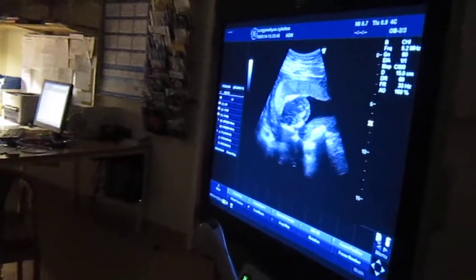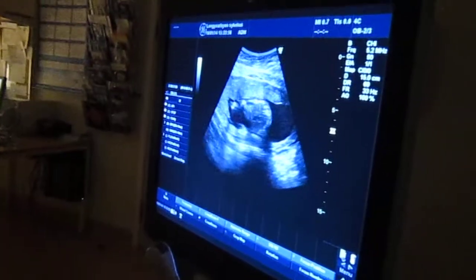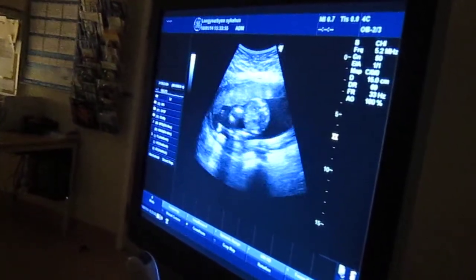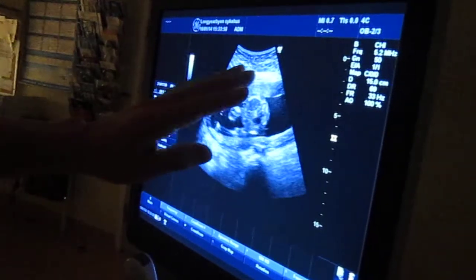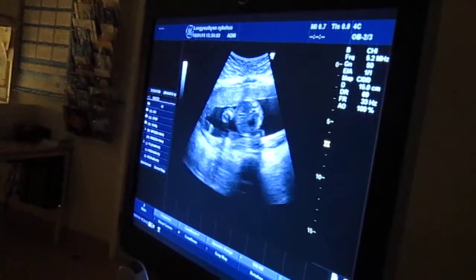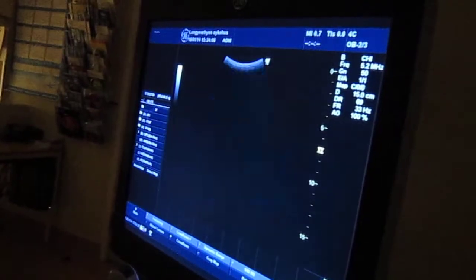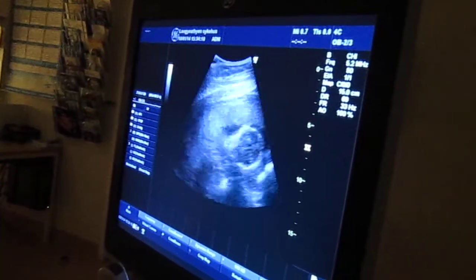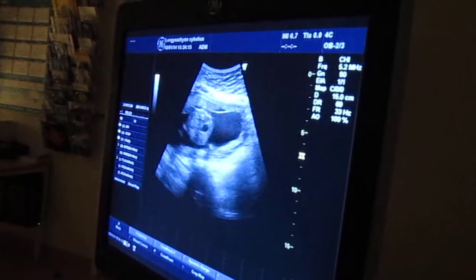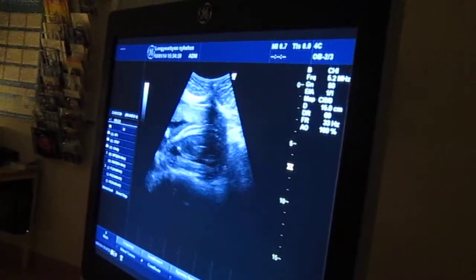So now I have to go a little bit round. You see the echo is not so very sharp because we have the placenta here, we have no fluid over here, so there is a little bit of shadow in the echo. And if there is some organ that I don't feel I see good enough, then we take a new ultrasound after some weeks just to make a control of this ultrasound. That's not because we think something is wrong, but to know that everything is okay.